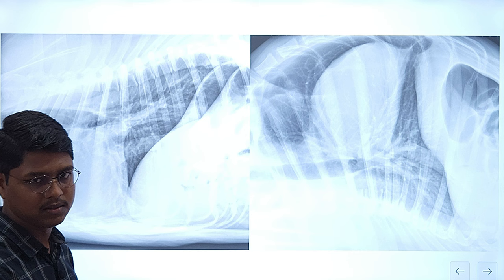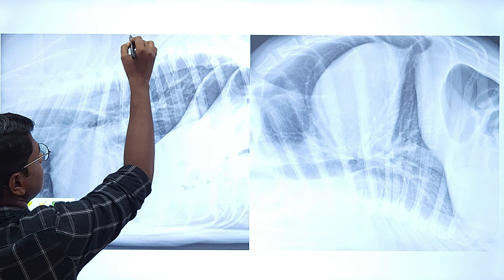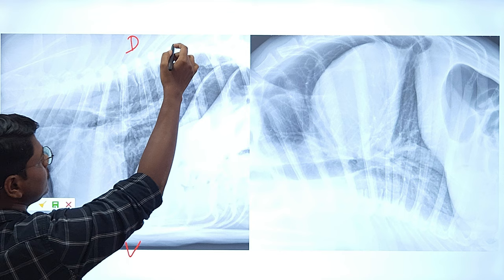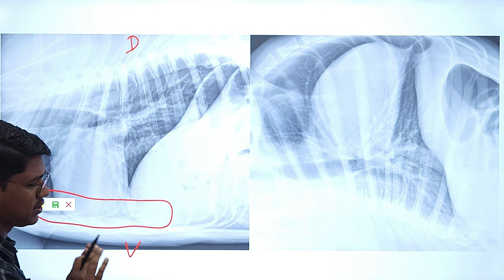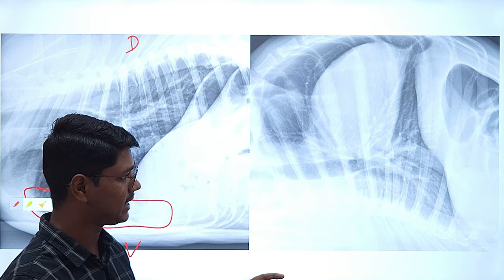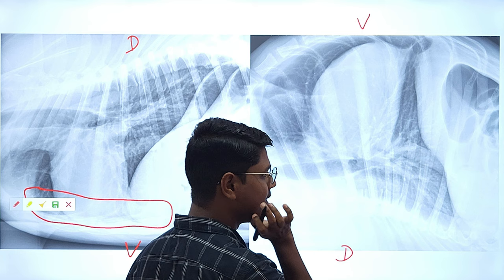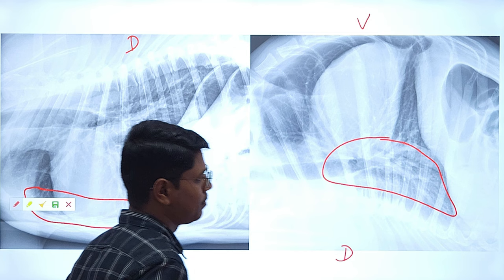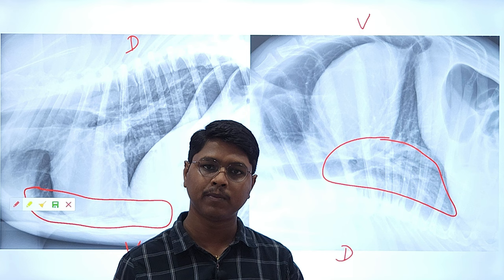Atelectasis not only happens in lateral radiographs — it happens extensively in lateral radiographs, but also in dorsal ventral and ventral dorsal radiographs. In dorsal ventral, only the ventral-most part may show some atelectasis, and the lungs are minimally atelectatic. In ventral dorsal view, you can see the caudal lobe which may be atelectatic. Keep in mind the phenomenon of atelectasis when interpreting the thoracic radiograph.